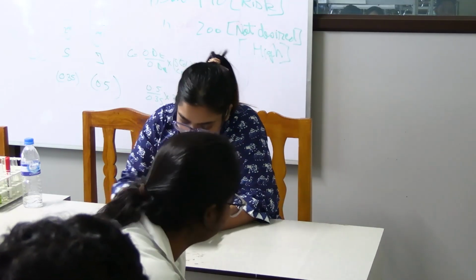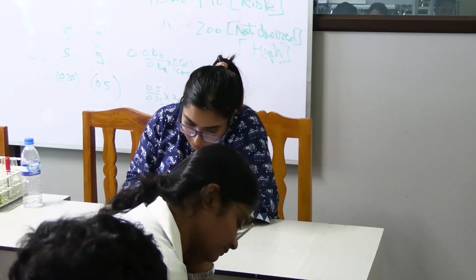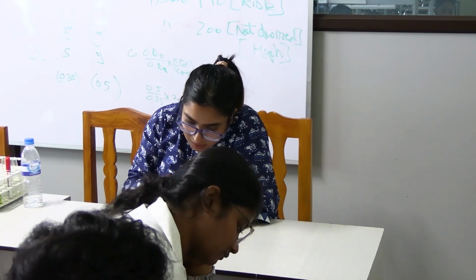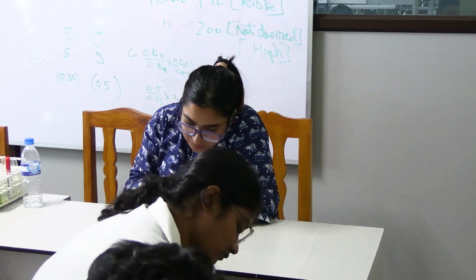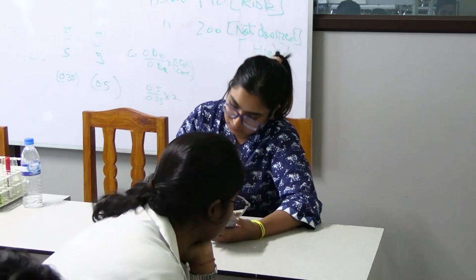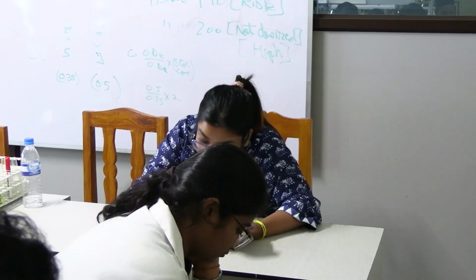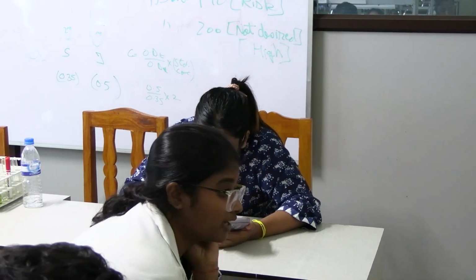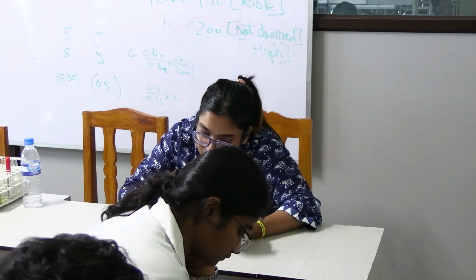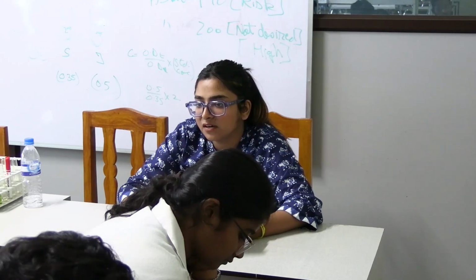Okay. Next case, right? pH 7.44, PCO2 34.7, bicarb 23.7. What is wrong with this person? Let me also diagnose with you. 7.44 pH is normal. Who said alkalosis, acidosis? pH is normal, nothing is there. Already it is compensated.